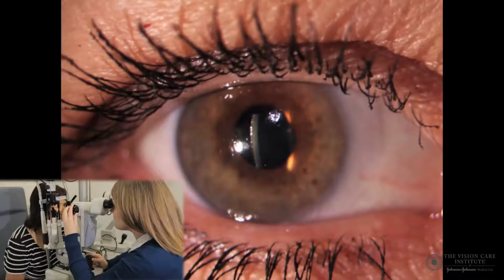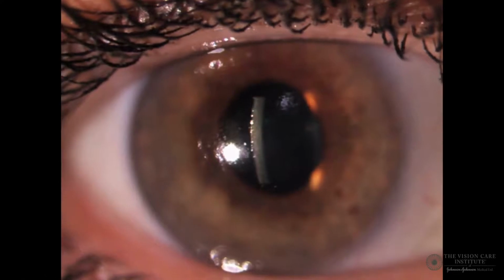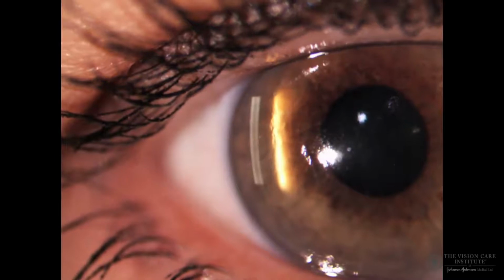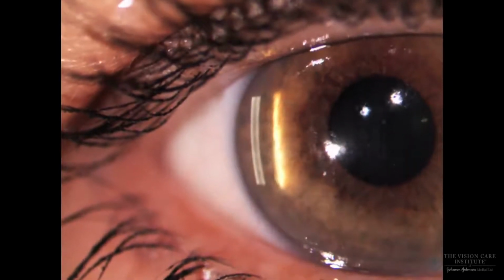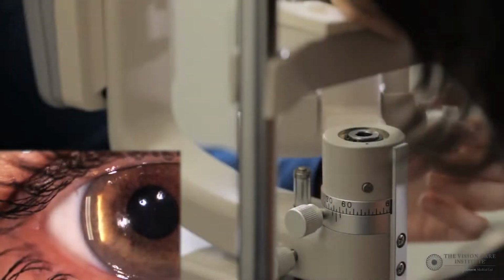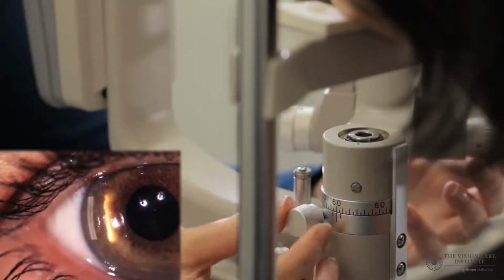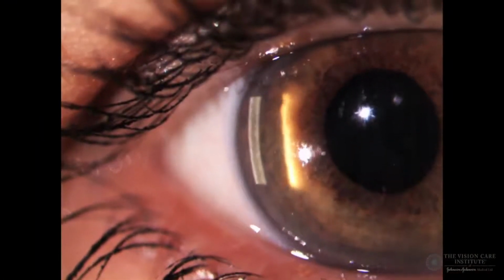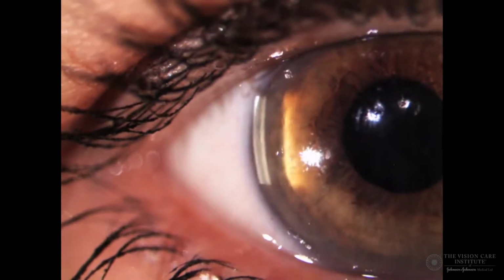Now that we have a clear, short corneal section, we move the section over to the temporal part of the cornea as shown here. When we have this clearly in focus, it is important to have the angle between the illumination and observation systems at exactly 60 degrees, as shown here. In order to ensure that this angle is maintained, we can lock the illumination system so that it always remains at 60 degrees. It is important to have the section on the very edge of the cornea, and then we can increase the magnification further.